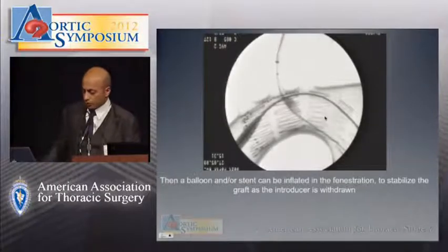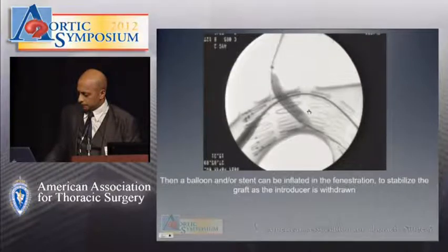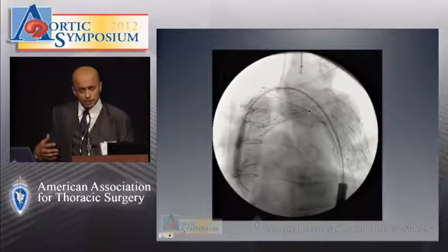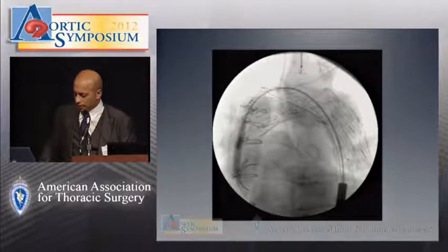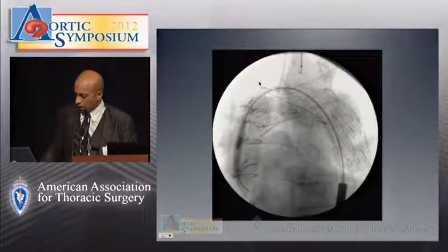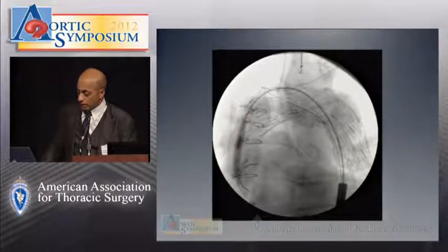You can also use fenestrations for the carotid, and the advantage of that is you can stent the fenestrations and maintain alignment that way. But the big problem I saw with these techniques, and I've been disappointed with the last two that I've proctored in other parts of Canada because they resulted in strokes, is that I think this preloaded catheter and wire rubbing across either the innominate or the left carotid is a source of embolic disease that we really can't control, and that's one of the reasons I don't like this technique. This last presentation by Dr. Yokoi has made me wonder if we really need that preloaded catheter wire for alignment.